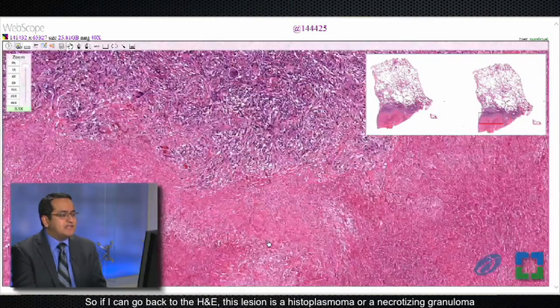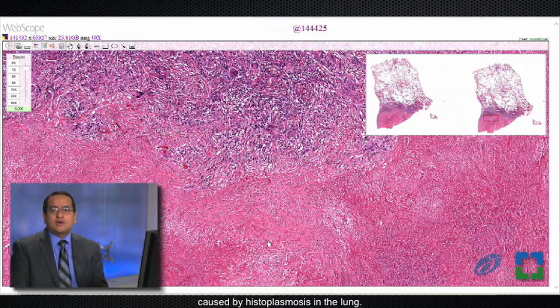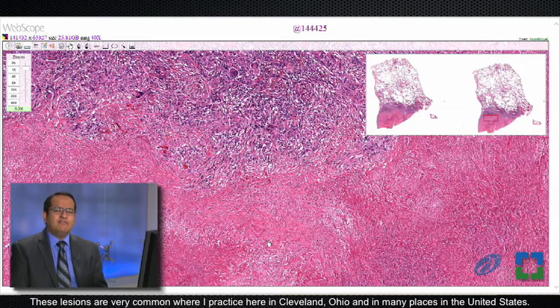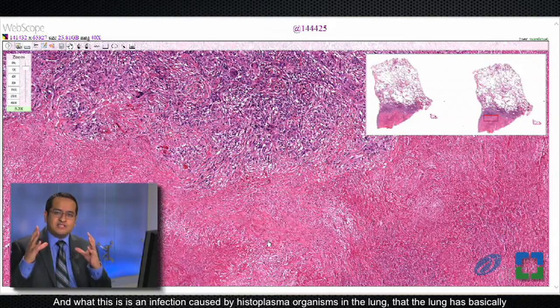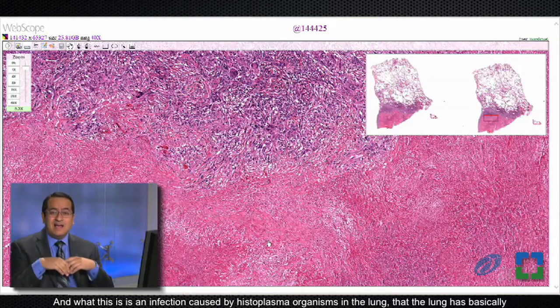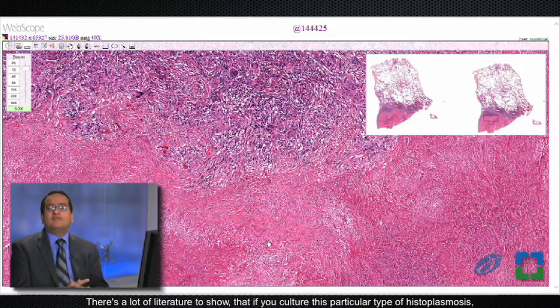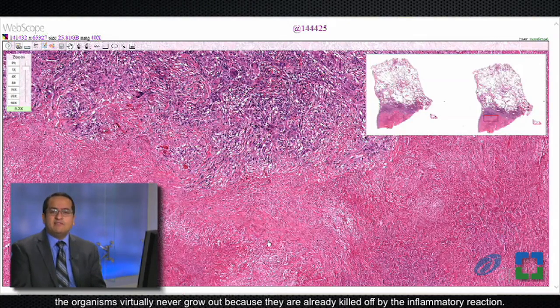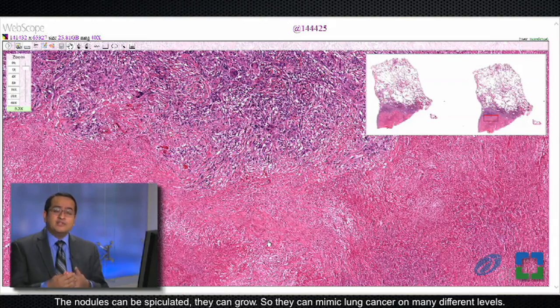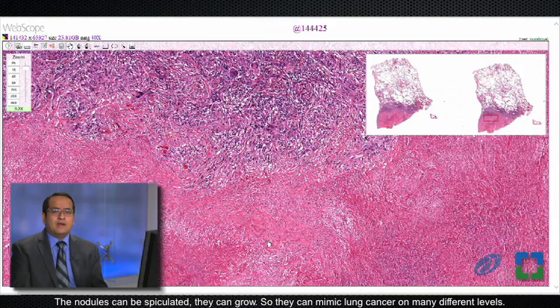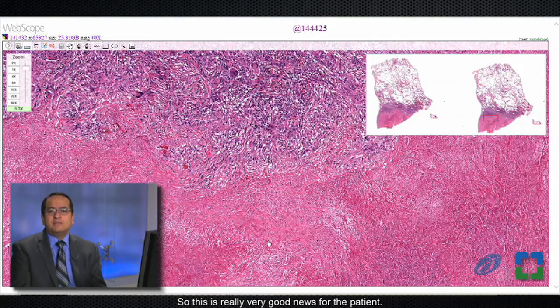So this lesion is actually a histoplasmoma — a necrotizing granuloma caused by histoplasmosis in the lung. These lesions are very common here in Cleveland, Ohio and in many places in the United States. This is an infection caused by histoplasma organisms in the lung that the lung has basically killed off. There is a lot of literature showing that if you culture this particular type of histoplasmosis, the organisms virtually never grow out because they've already been killed off by the inflammatory reaction. These lesions can be PET positive, the nodules can be spiculated, they can grow — so they can mimic lung cancer on many different levels.